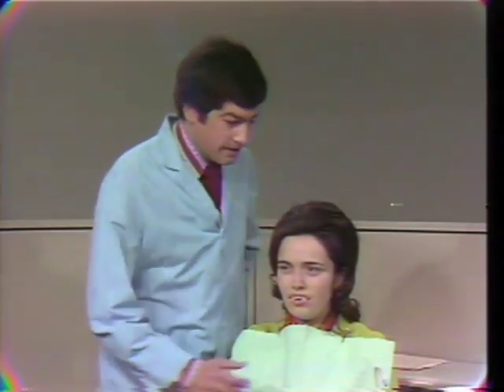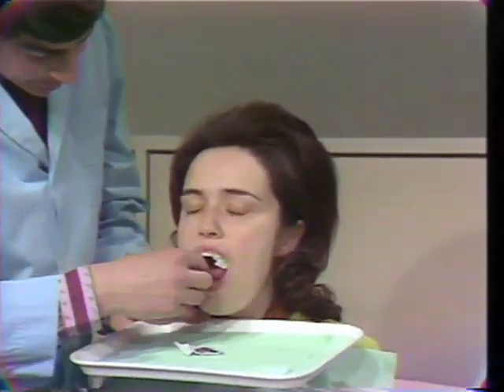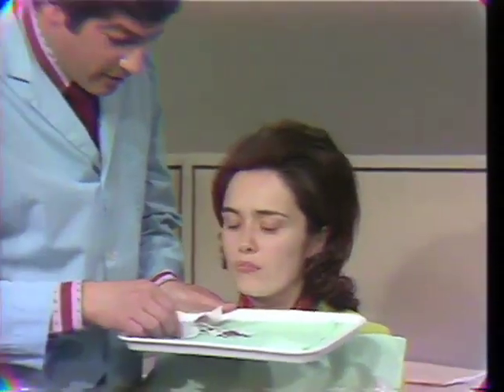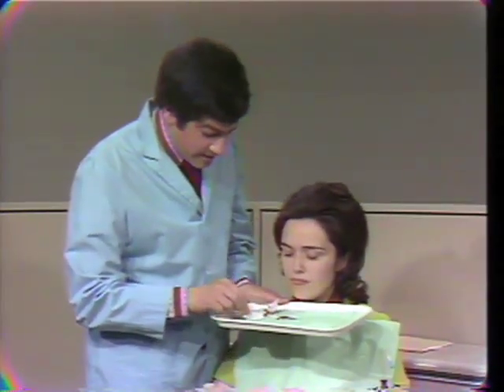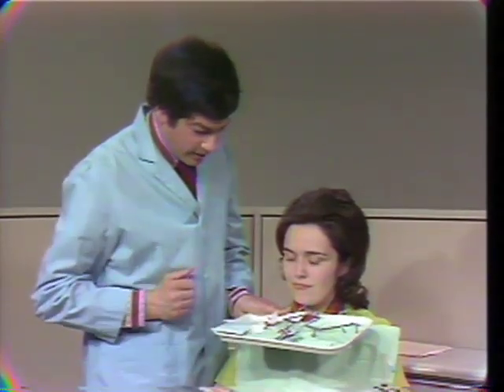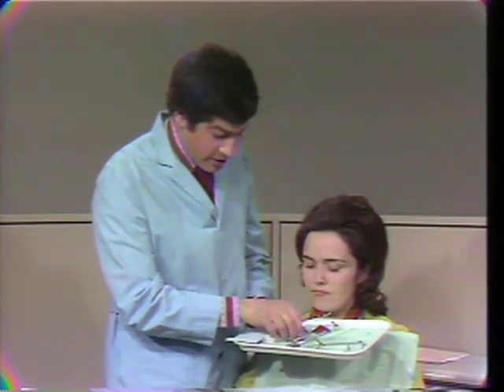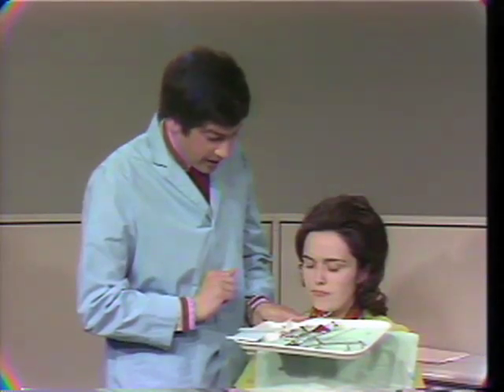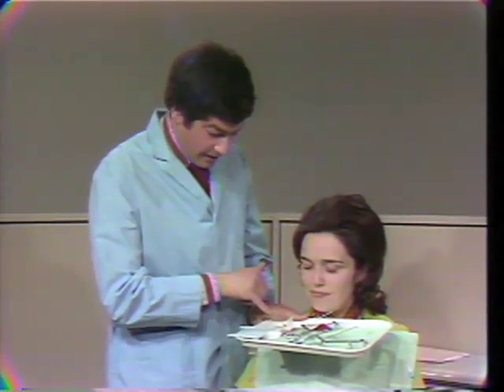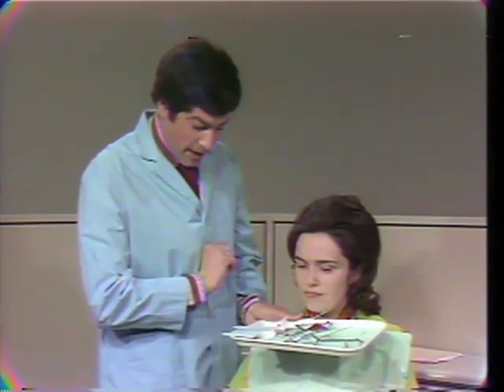The plaster is set. I take the tray and remove everything from the patient's mouth. I verify that I have everything: the two keys, the face bow for the transfer, and the condylar path tracing. That is all I need for the moment from the patient — the central bearing pin and the registration plate. I may also need the patient again if I want to confirm the position of the condyles in their fossa by radiography in the position we keyed the mandible to the maxilla. Now we are ready to go back to the lab.